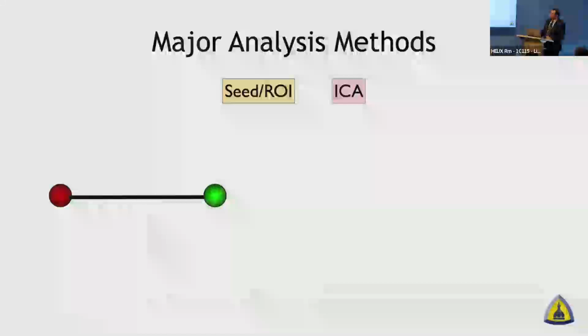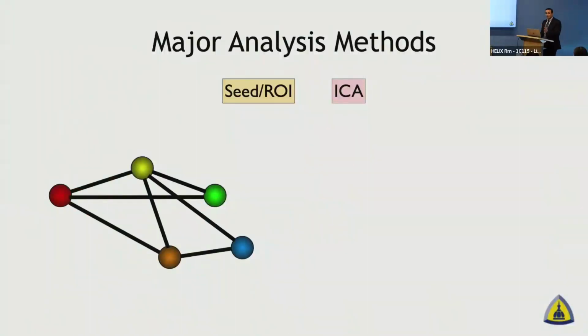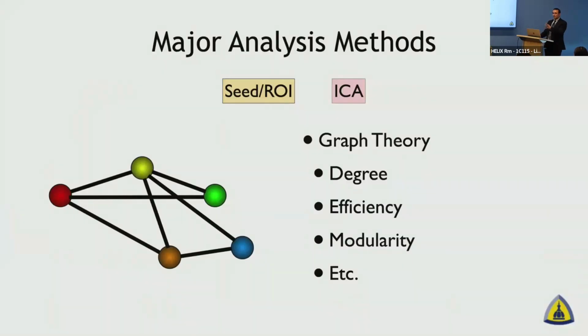Or you could do what we did earlier, which is pick two regions and ask what the correlation between them is, and you can get some numbers. You can pick multiple different brain regions, which we did earlier, but we took them individually, right? But you can also do things like graph theory, which summarizes relationships between different regions of interest and then calculates metrics of this system itself to end up with a single numeric value.